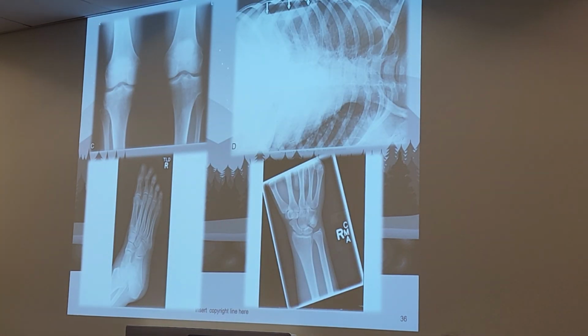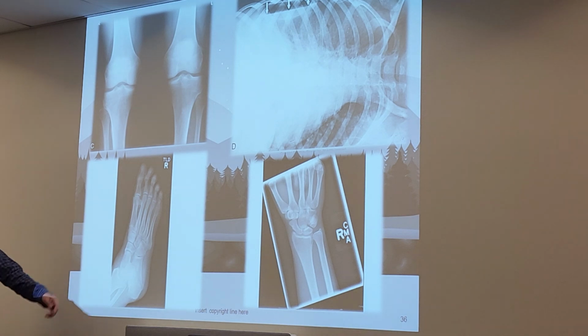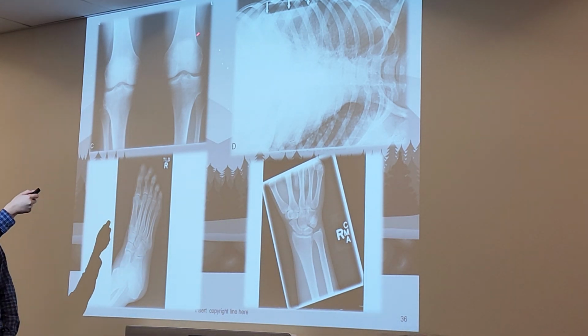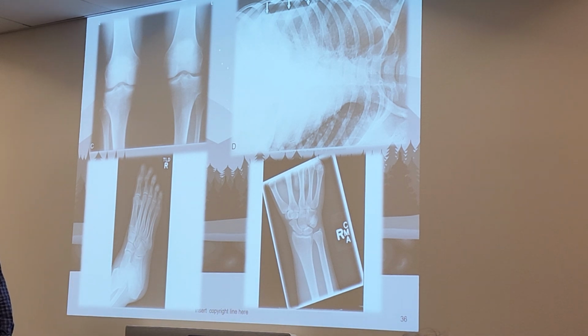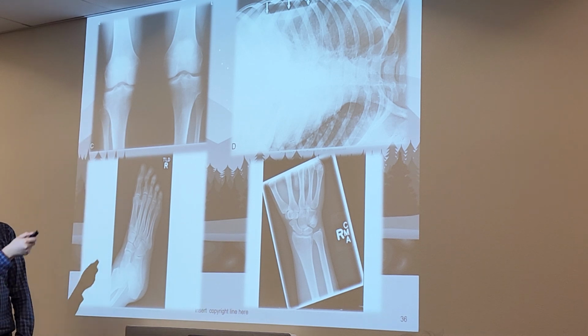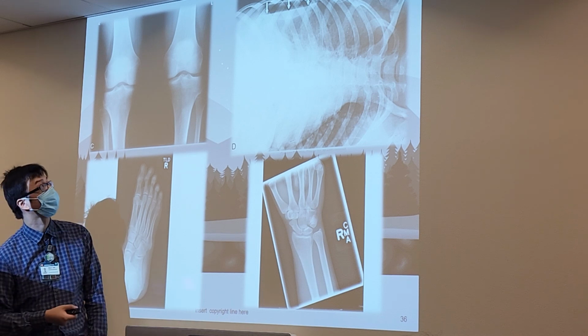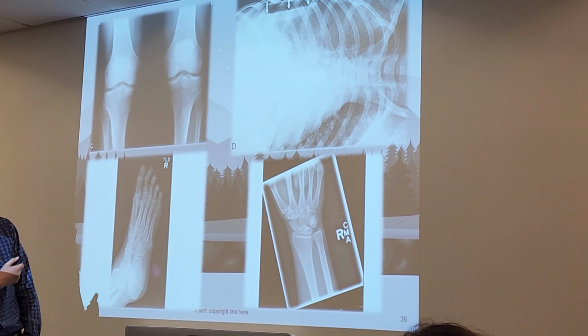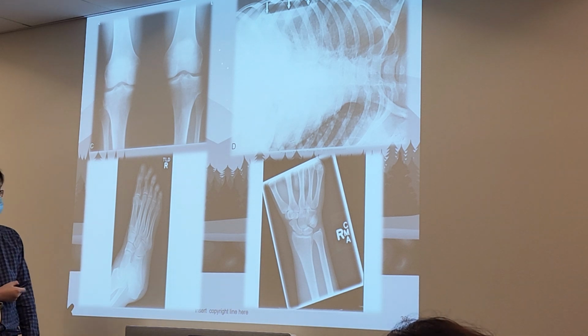All right, and so these are some examples of markers. Right, so over here, do you see that marker all the way up here at the top? This, not ideal. Why? Because that is a digital marker. Because what, sir? That looks like a digital marker to me. It looks like it was put on after the fact.